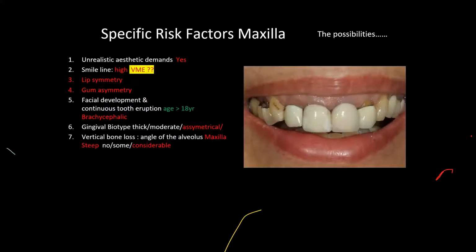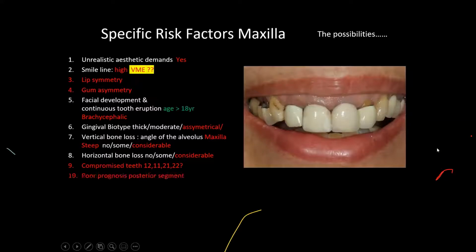And when you look at the bone loss, horizontal bone loss, I feel the anterior 4 teeth are highly compromised. Canine seems fine. Okay, and again, posterior segment we have poor prognosis, and naturally bone volume. Well, bone volume is not too bad. So these are important considerations I need to make. Okay, and look at then occlusal factors.